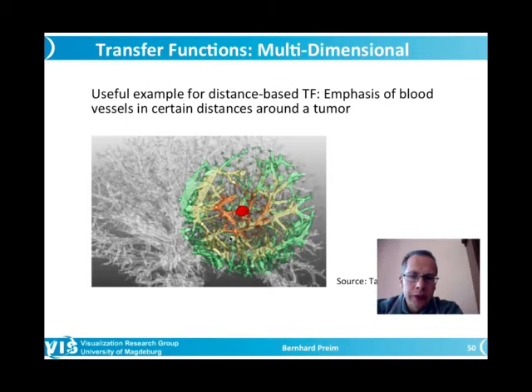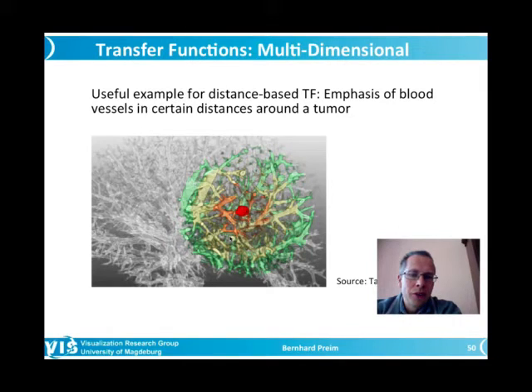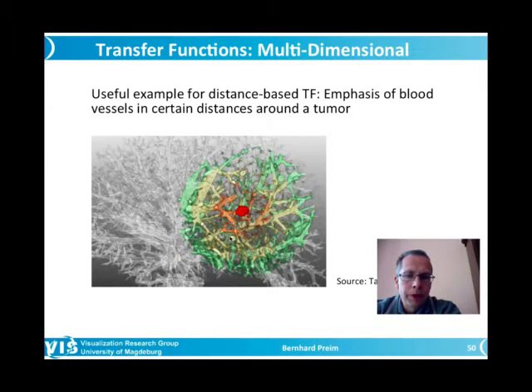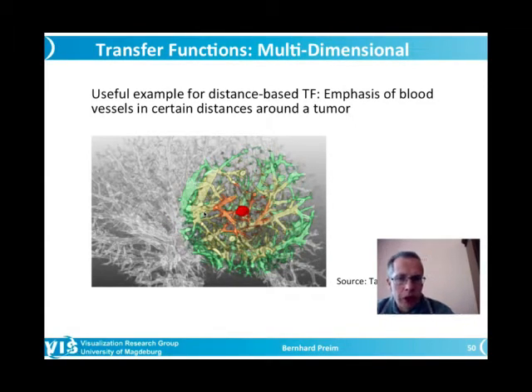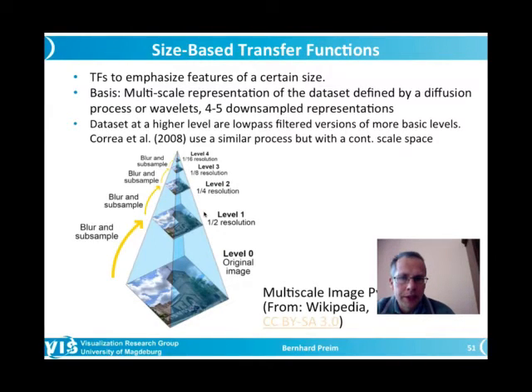Here we have three different colors representing vascular structures in different safety margins around the tumor. Since the tumor is already red, we use orange, yellow, and green. The green vessels are already quite safe — probably they do not need to be resected. But the orange vessels at the 5mm security margin, and the yellow vessels at the 10mm margin, definitely need attention and may need to be resected. That could be realized with distance-based transfer functions.